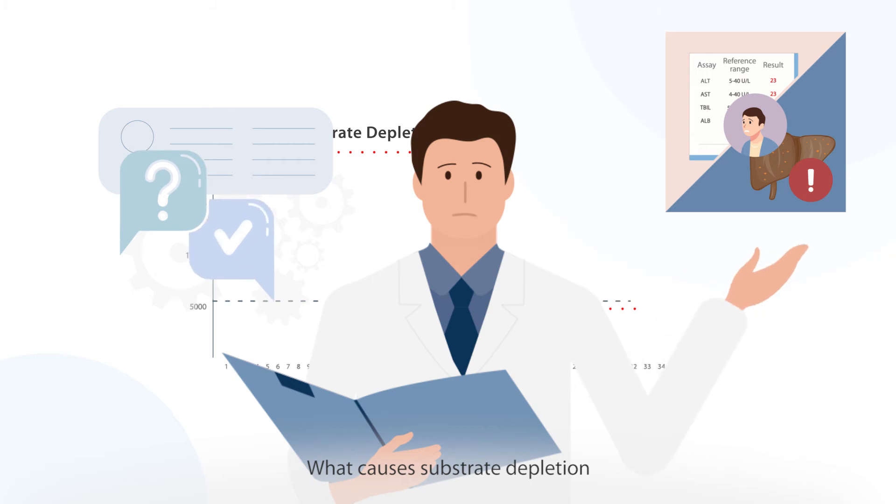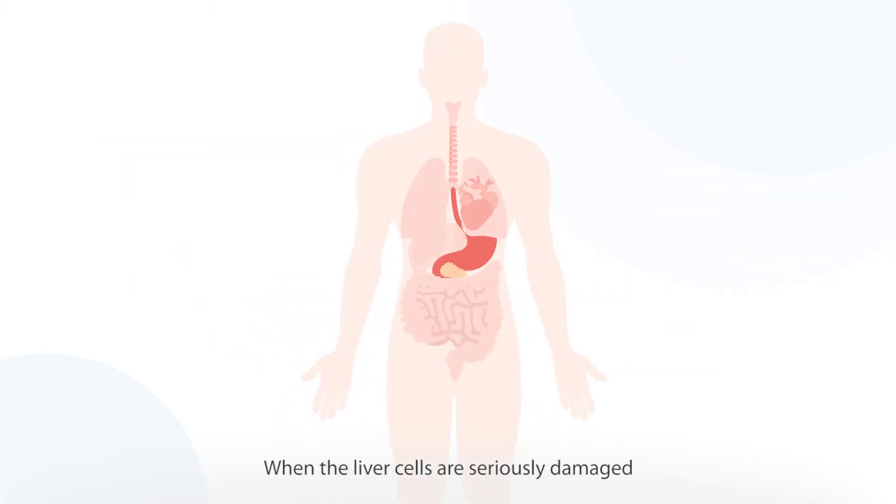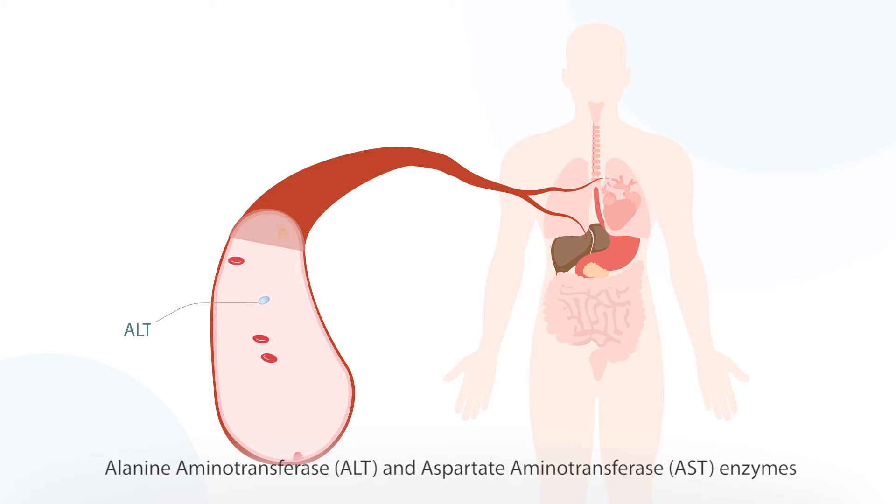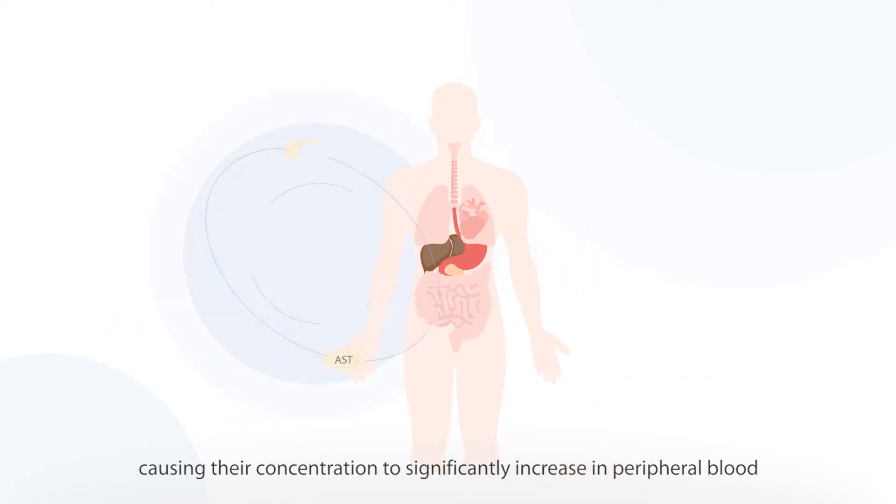What causes substrate depletion? When the liver cells are seriously damaged, alanine aminotransferase and aspartate aminotransferase enzymes are released in large quantities causing their concentration to significantly increase in peripheral blood.